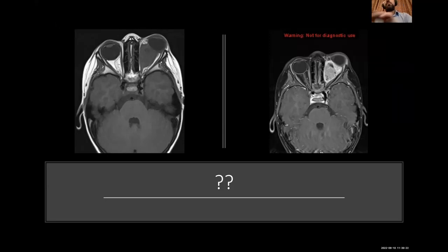No, I will tell you the keywords of this case. The patient is a young patient, around 7 to 8 years old. What is the most common mass, if I rule out hemangioma and the muscle is involved and indistinct?